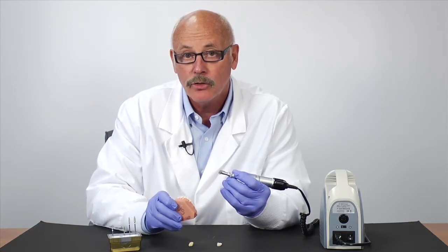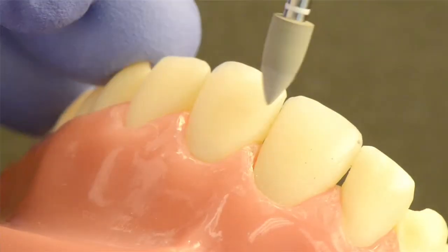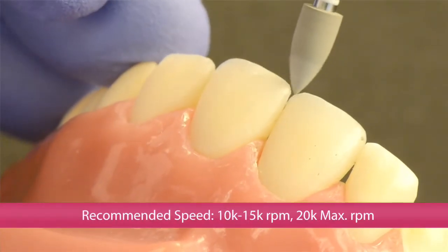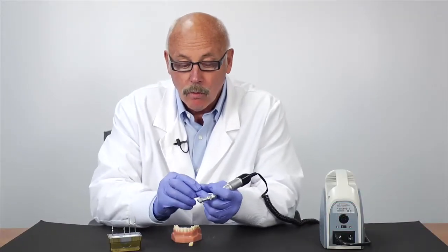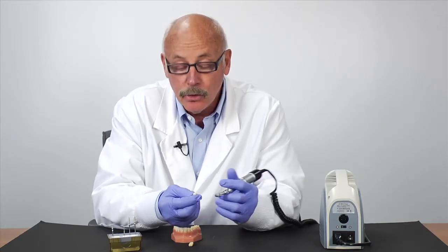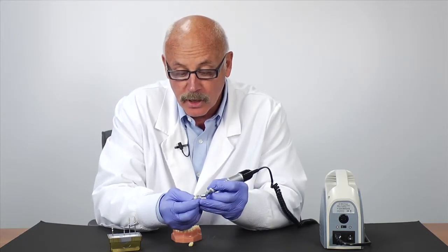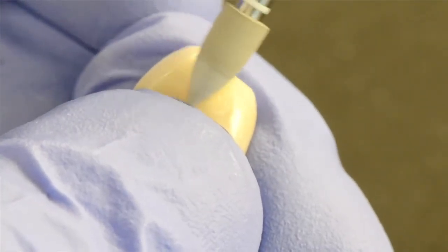Use Sara Master for super shine to get the tooth back to its original luster. It's easy to follow the contours of the tooth wherever you've pre-adjusted. When you've broken the glaze from a laboratory crown, use Sara Master Coarse first, then follow through with Sara Master to get the super shine, which is more durable.